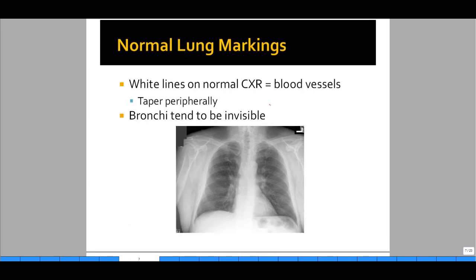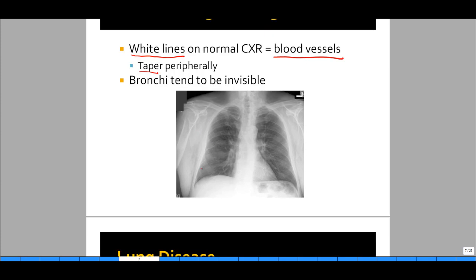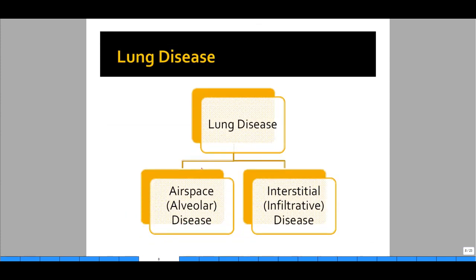Now let's try to identify lung disease. Before you know what abnormal is, you need to know what normal lung markings are. Normal lung markings are white lines on the chest x-ray that represent blood vessels. They taper peripherally — they may appear larger toward the hilum but get smaller toward the periphery of the lungs. Bronchi on a normal chest x-ray tend to be invisible, and we'll talk about when bronchi start becoming visible and why. In this chest x-ray, you'll see long, very thin lines starting toward the hilum and extending out — those are blood vessels.